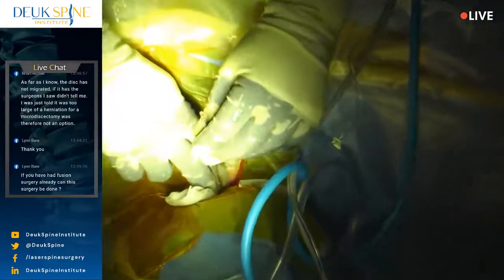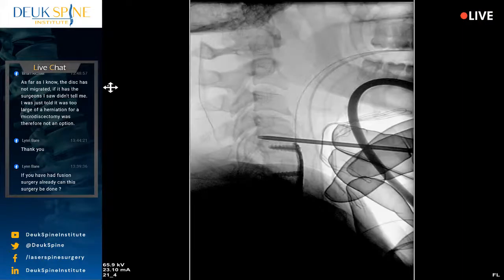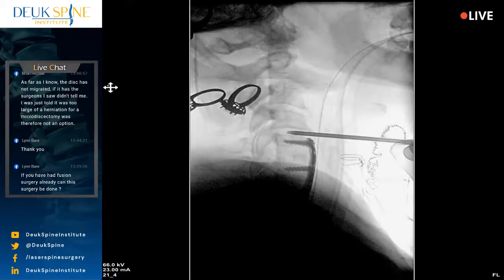All right. Shot. Let's see where we are. All right, so you're just going to keep that fluoro there. That's perfect. And I'm going to move this north. I need that wire out of the way. You got to be watching. Don't let that fall. This loop is blocking me. You got to pay attention. All right. You guys ready? Here we go. Little traction, extension. Just hold it. Shot. Coming out of the disc.